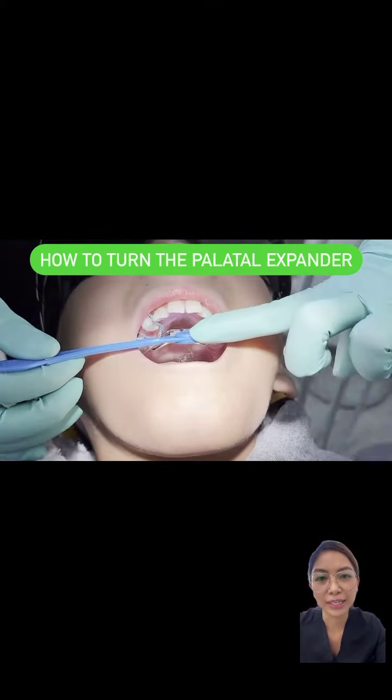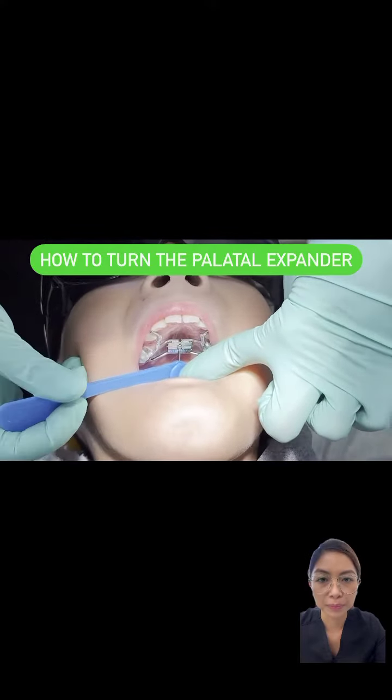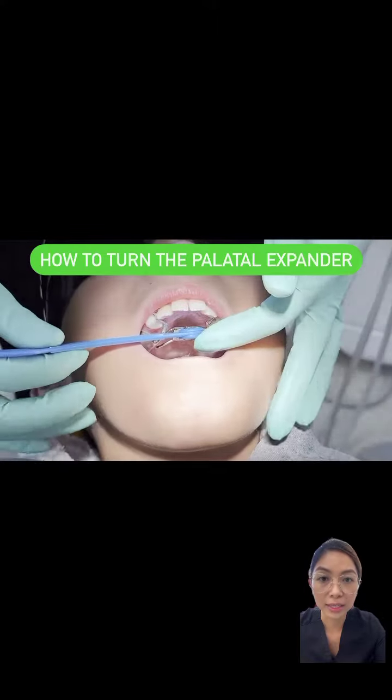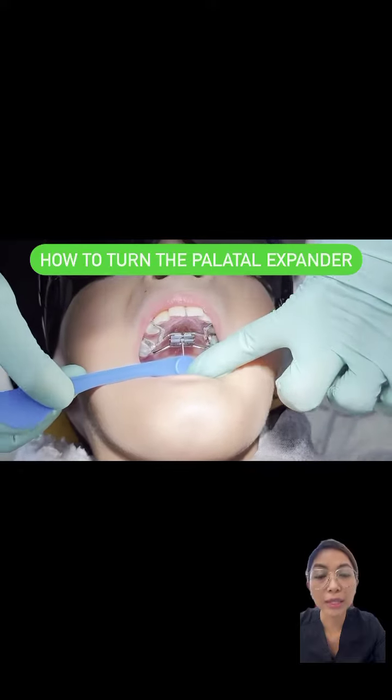Here is a video of how to turn the expander. Make sure you insert the key in the middle of the hole. Once it's secure and once you feel that it slots in, then you can gently push the key towards the back of the mouth until you feel it stop.